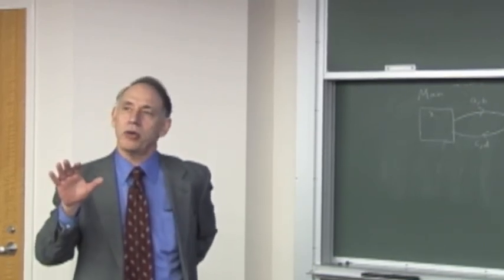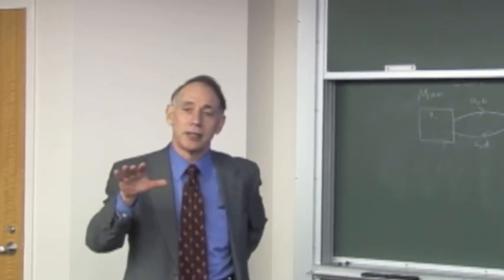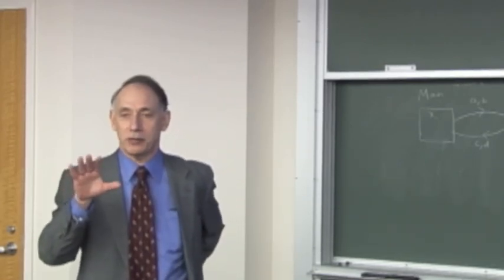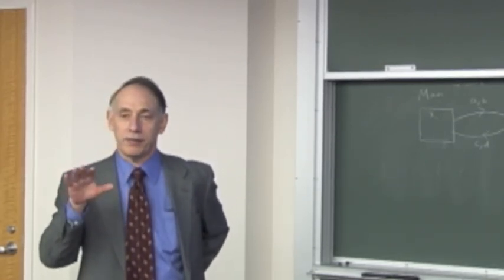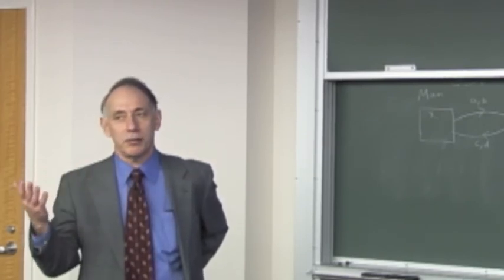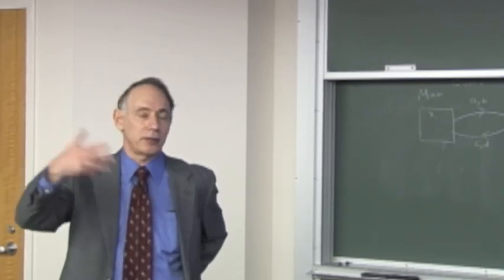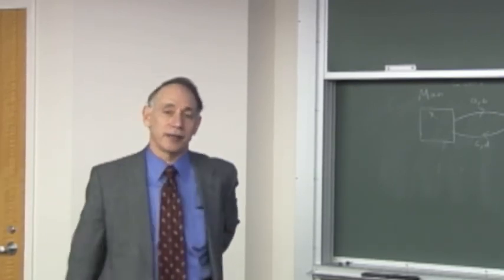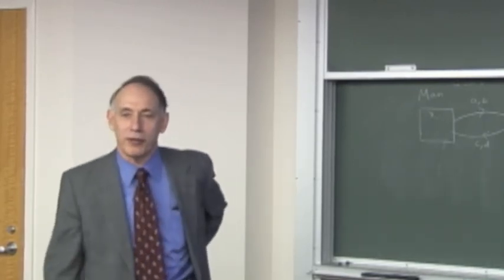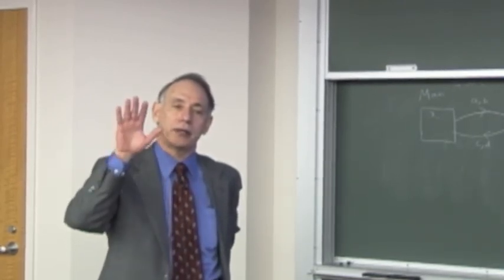We measured all this, and there's 50 grams of force on the device. Two stationary golf balls weigh about 50 grams. So that's how much force is exerted by the magnetic field on the device. And the heating of the leads is really probably trivial, because all the EMI protection that's been built into the devices pretty much makes them MRI safe. They didn't have all that in years past when all these horrible things were reported. And in fact, nobody who's been monitored during an MR exam has died.